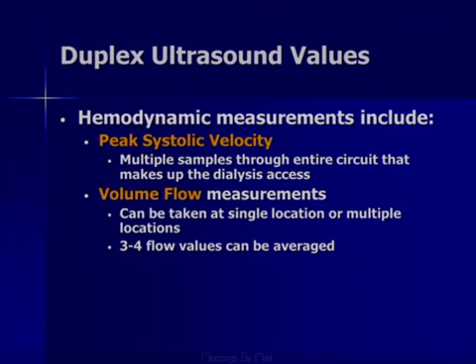Predominantly what we measure on ultrasound are two different things. We're either measuring velocity or we're measuring volume flow, and actually we're going to be doing both. In terms of velocity, we're going to take it over multiple sites, but with volume flow, we're usually going to pick a singular location and take our measurement there, and I'll discuss where best to take that.